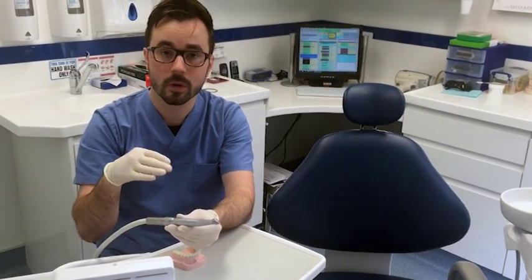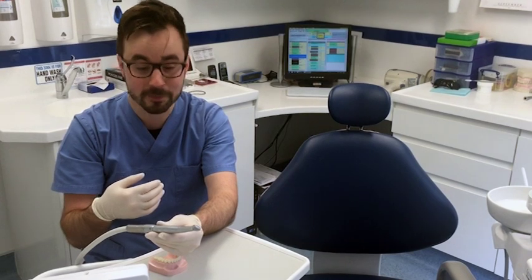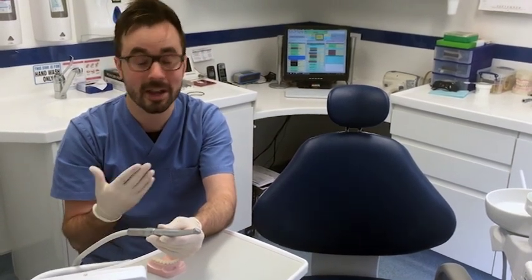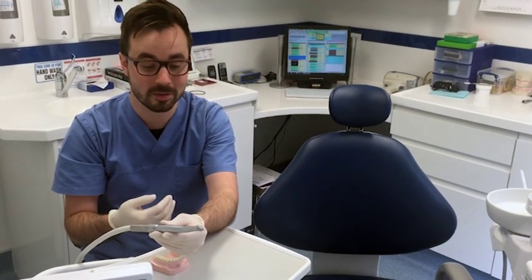The drill spins at 500,000 RPM, which is very fast, and it makes short work of fillings and any other procedures that we need to carry out.